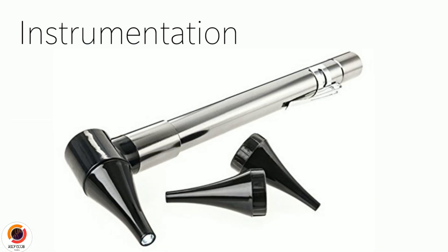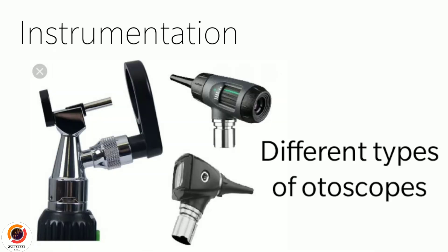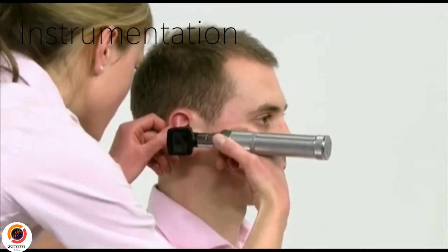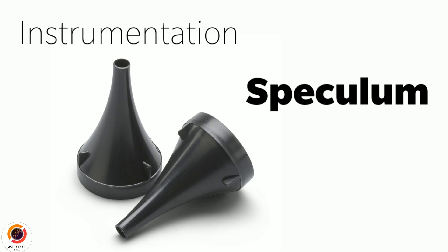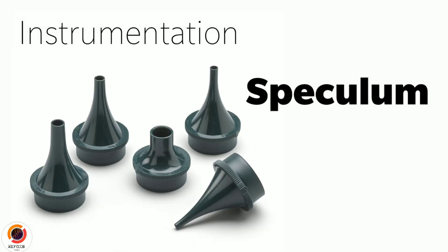Now let me show you how an otoscope looks. This is an otoscope. There are many types, but most commonly used otoscopes consist of a handle and a head. The otoscope contains a light and magnifying lens to illuminate and enlarge ear structures. As the ear canal is very narrow and it is difficult to view internal structures, health providers use a speculum with the otoscope. There are often multiple speculum sizes for attachment, and according to the size of the patient's ear canal, the appropriate speculum is selected.